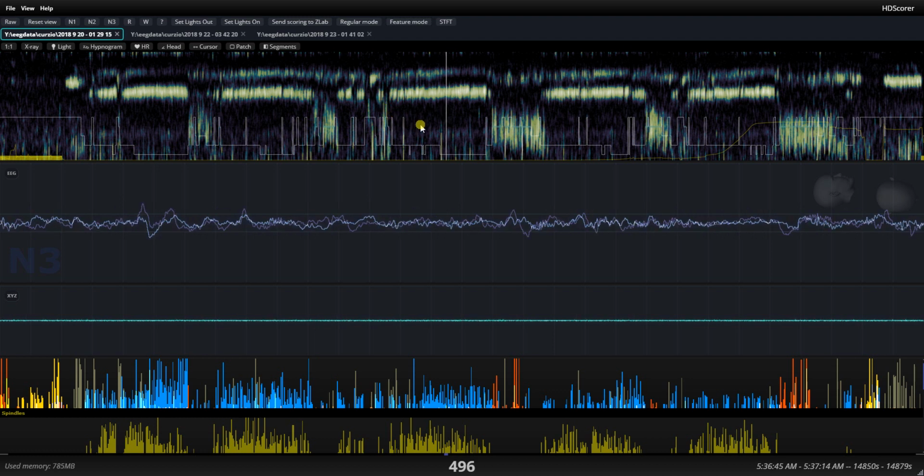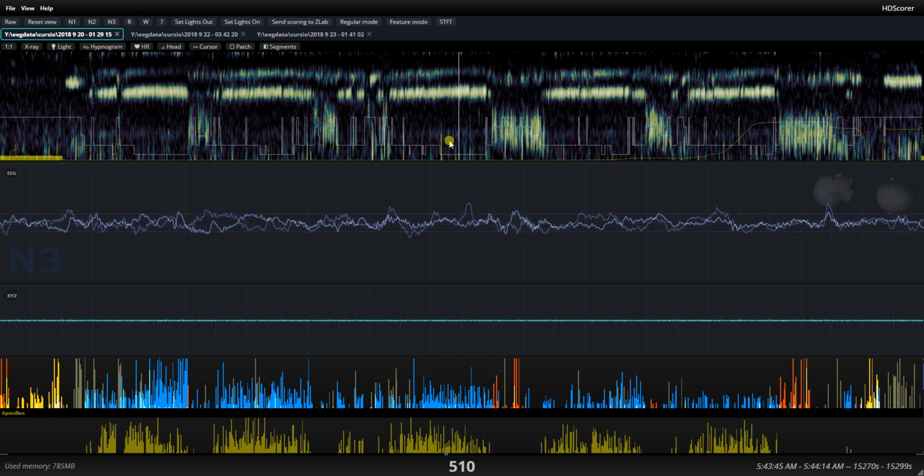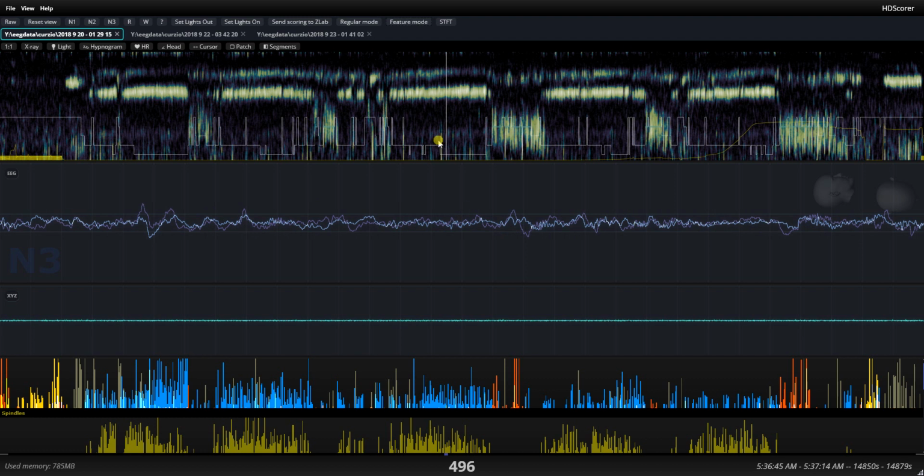But what I've done here is, remember I was telling you about the intensity of slow wave sleep and how the barrier between N2 and N3 is artificial. I am actually smoothing that out a little bit. I'm not interested in seeing very many transitions from N2, N3, N2, N3, because I know that's not going to be biologically very significant.